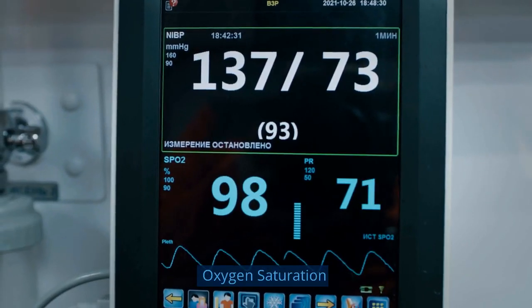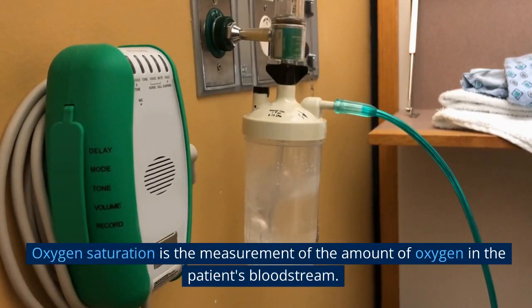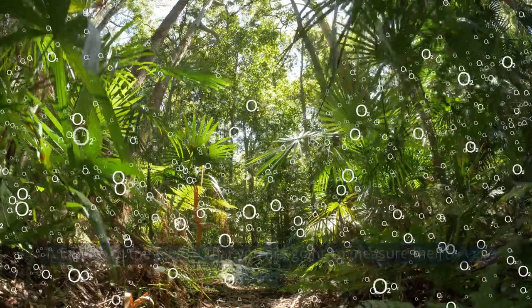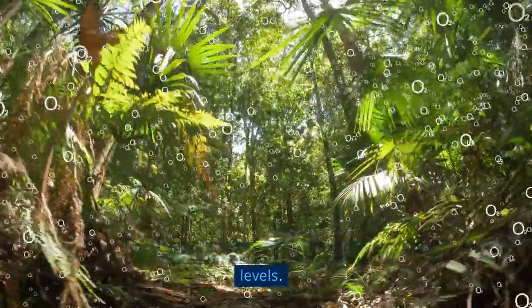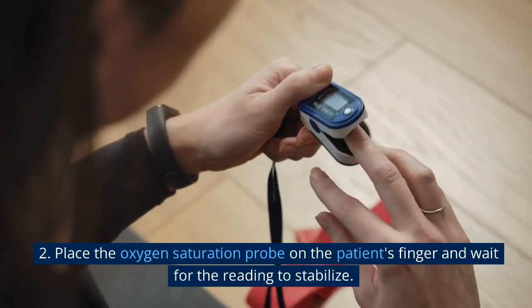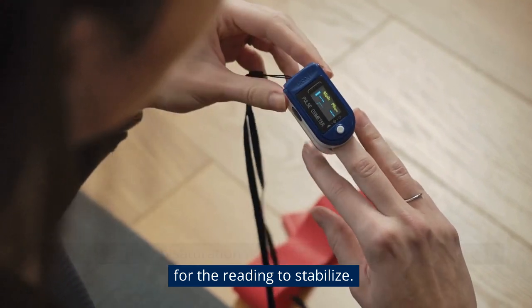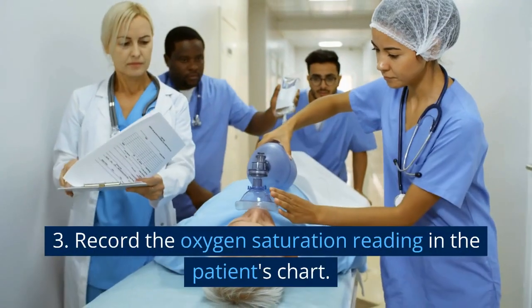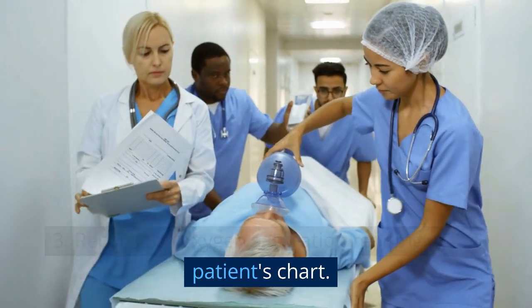Oxygen saturation. Oxygen saturation is the measurement of the amount of oxygen in the patient's bloodstream. Step 1: Explain to the patient that you are going to measure their oxygen levels. Step 2: Place the oxygen saturation probe on the patient's finger and wait for the reading to stabilize. Step 3: Record the oxygen saturation reading in the patient's chart.